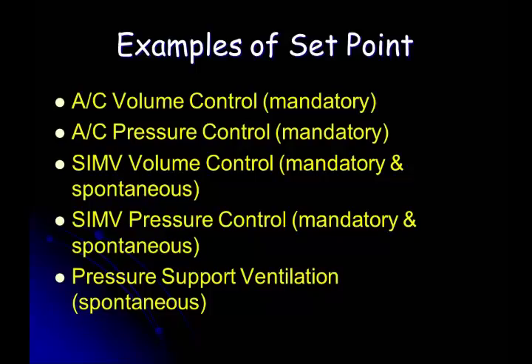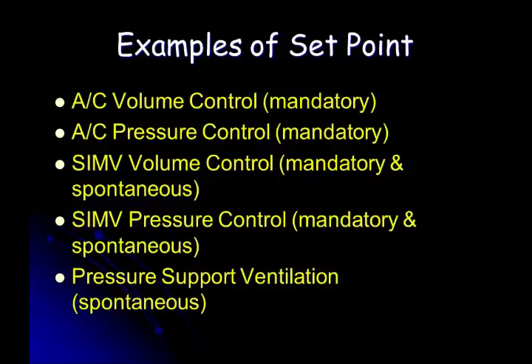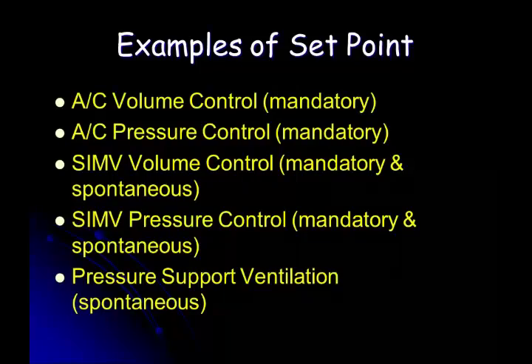Assist control, pressure control. Go ahead. Can you use this when you're weaning the patient off of the ventilator? No. This is typically, assist control is typically a mode which is utilized for full support. Okay. We don't really wean patients. We liberate them. We just take them off.